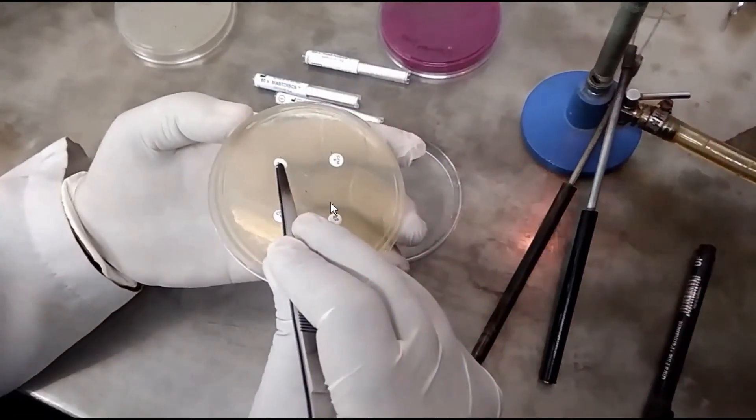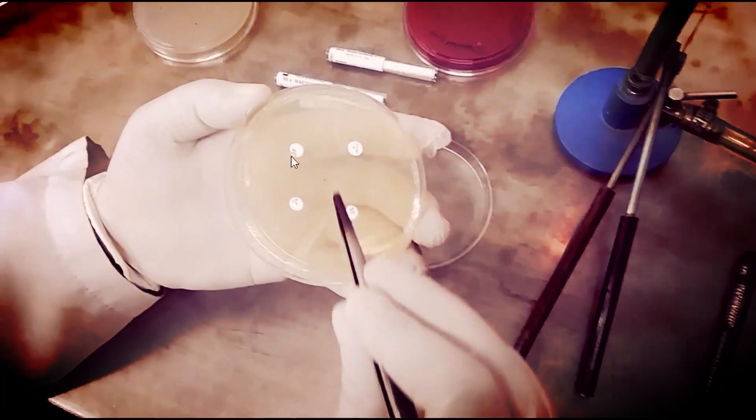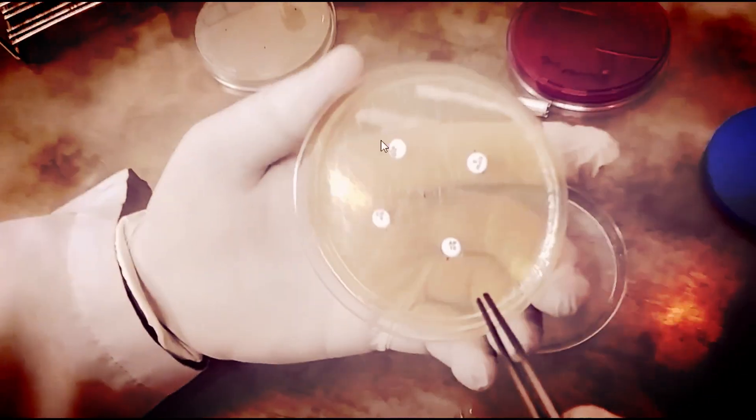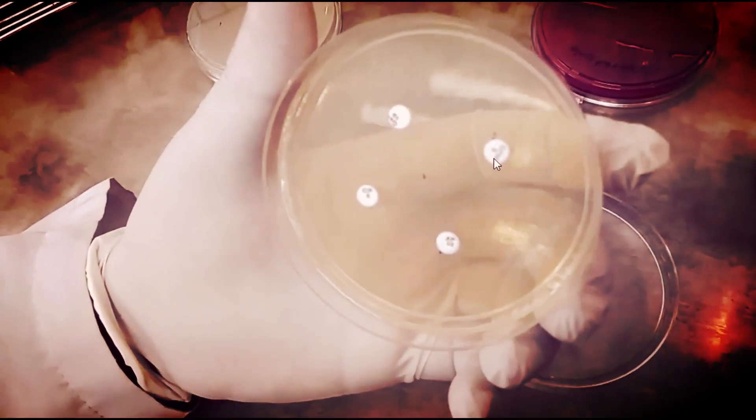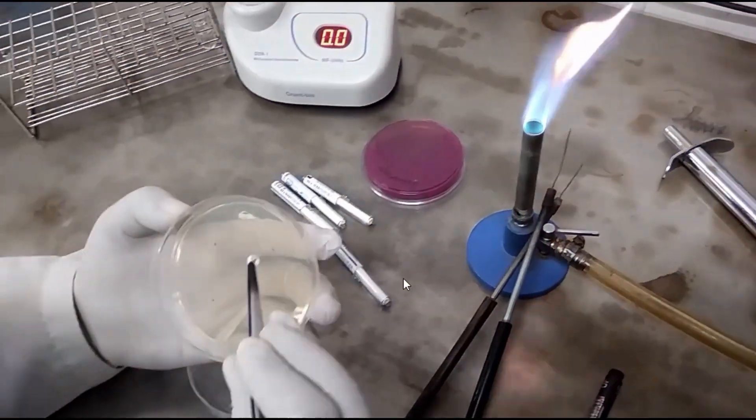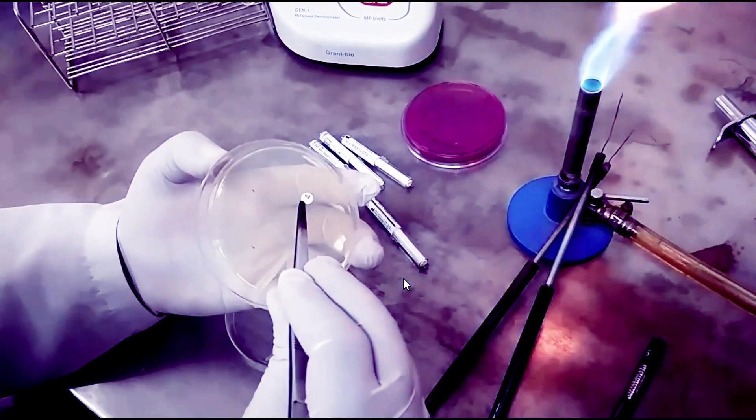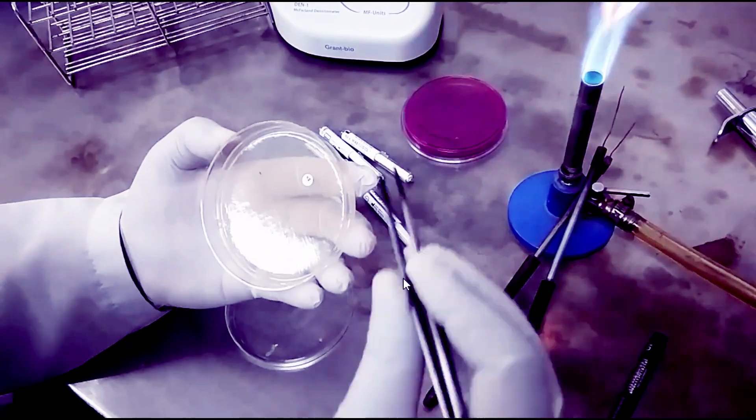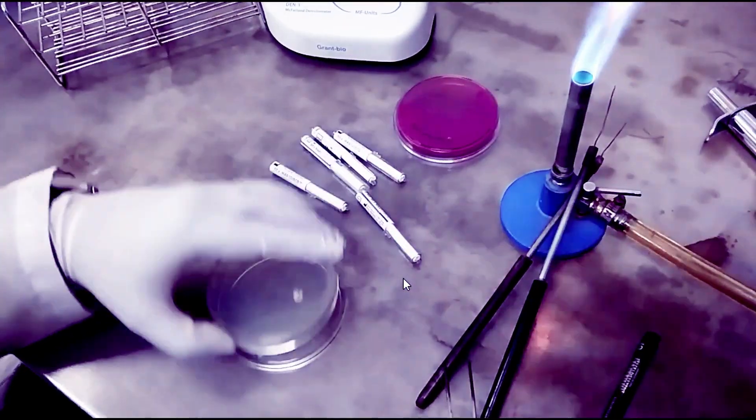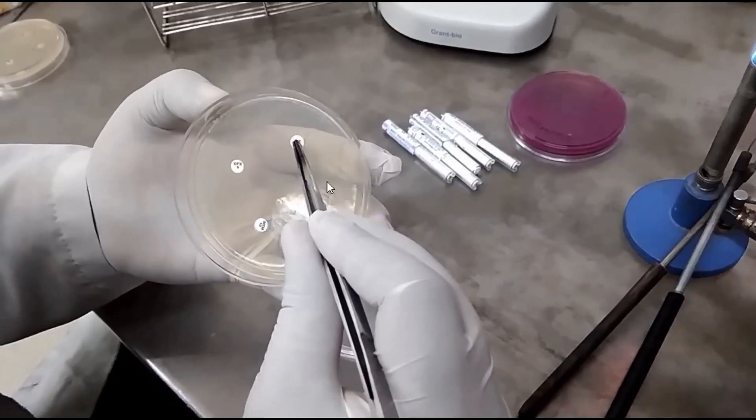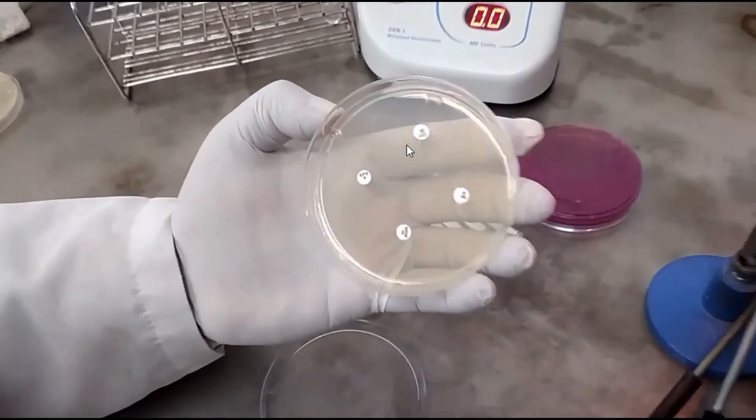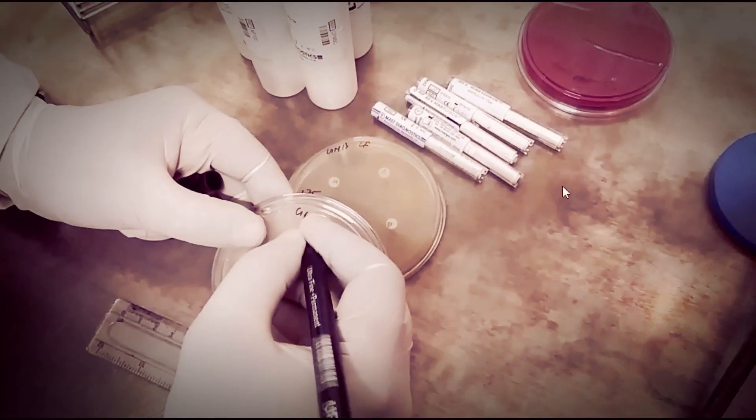Disc-to-disc distance should be 25 mm and disc-to-border 15 mm. Based on this, we can only put four discs per plate. That's why we have two petri plates to cover first-line drugs.